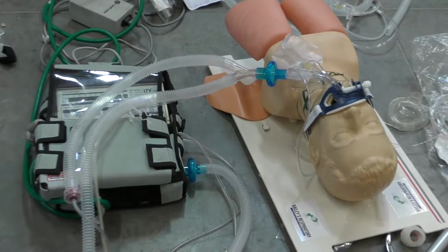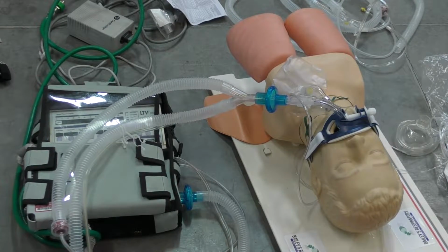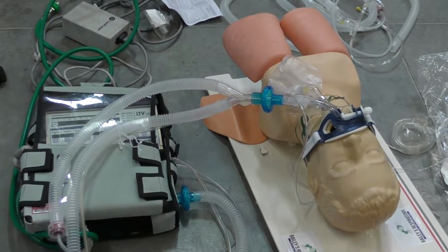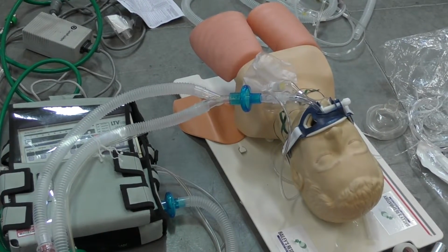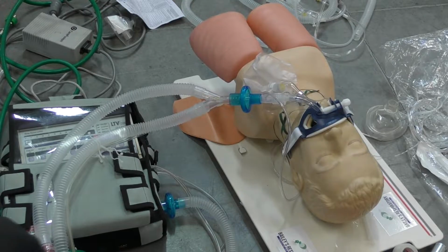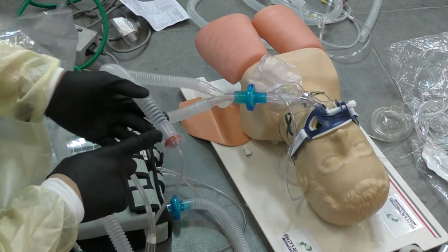Okay, so let's take a look at our setup. We have a patient who has suspected COVID-19, and you notice that we have two filters in our LTV ventilator. That's because we're going to need it, because our exhalation port is actually here.